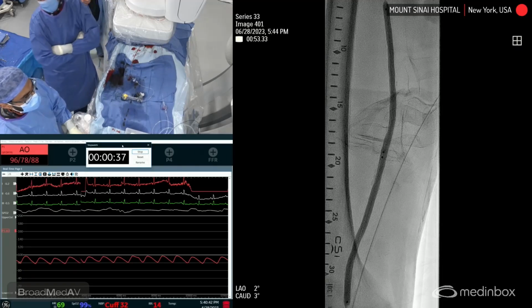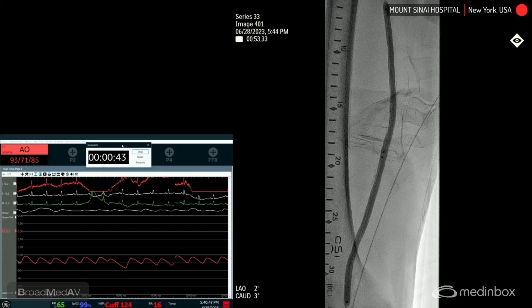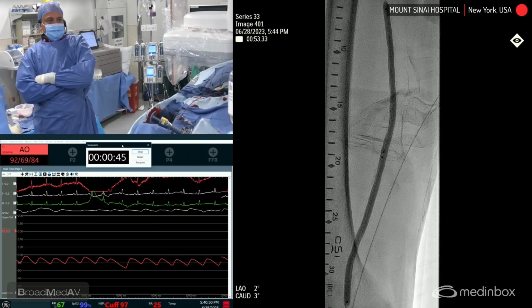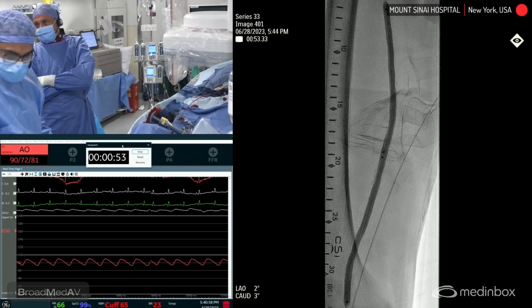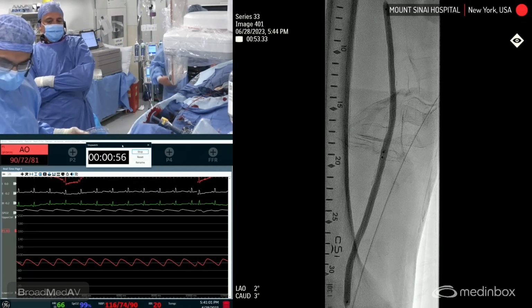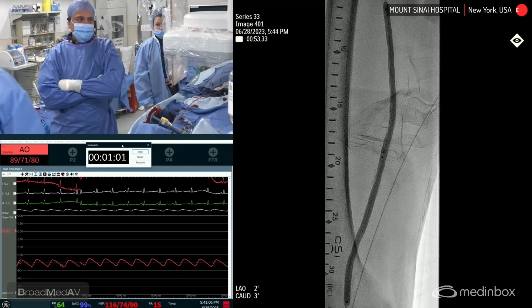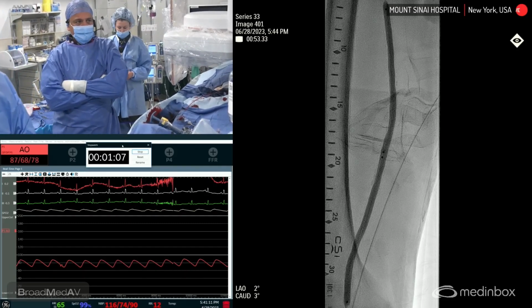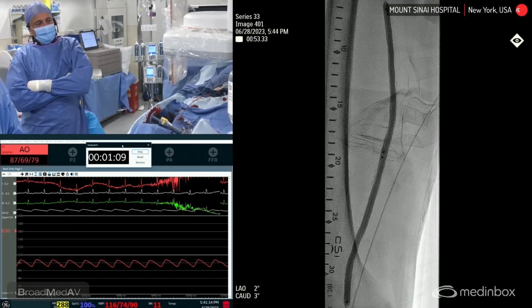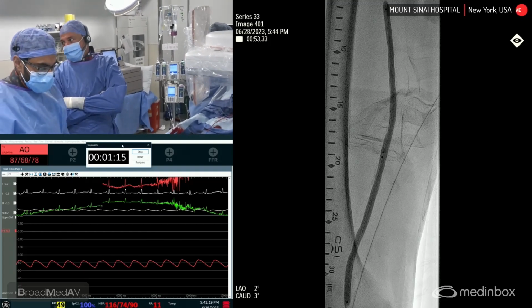So we're going to leave that up. Any questions from the audience, Liz, as we let the drug do its work? You can see it's a very robust sizing of this particular vessel, and hopefully this will work. So about two and a half to 3 minutes of this balloon, and then we'll take a picture and decide what we're going to do. There's a little bit of recoil around 15, so possibly that's the spot where we're going to have to put a Supera to be able to prop it open.